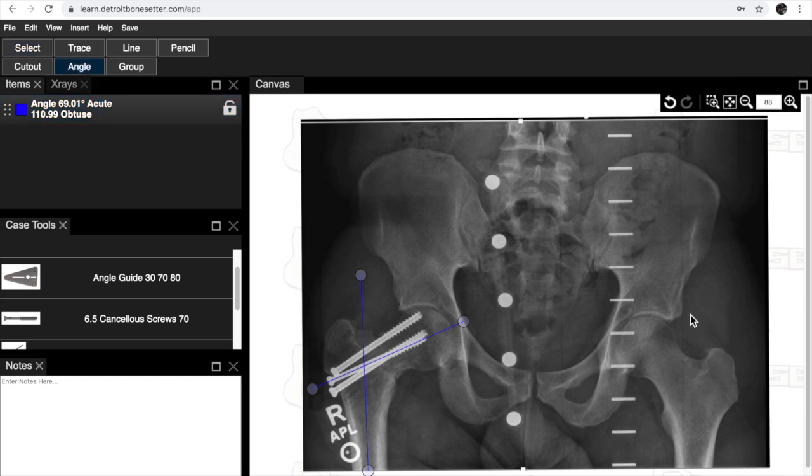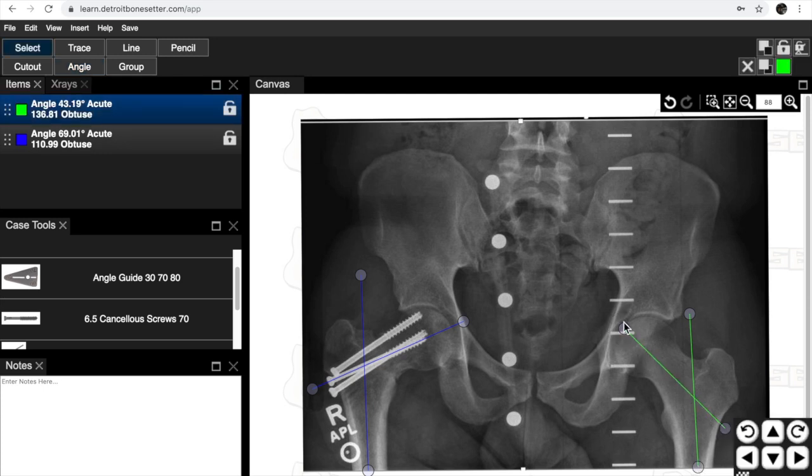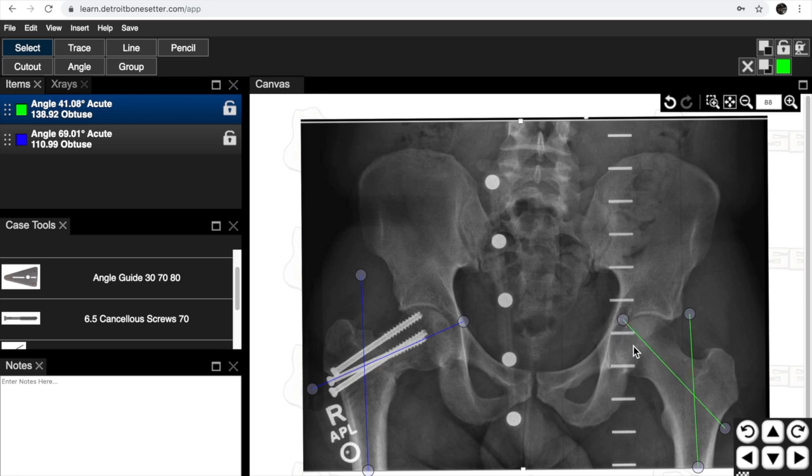Then you can do the same on the normal side. Just like that. You can move it and it should be about 30 degrees difference, 140 on this side and about 110 on that side.